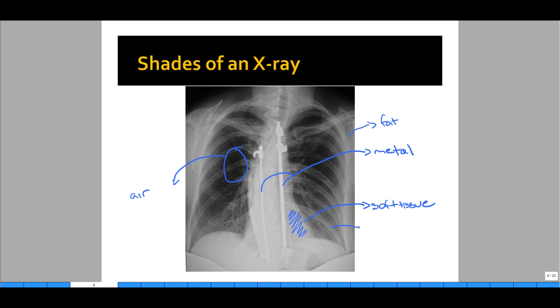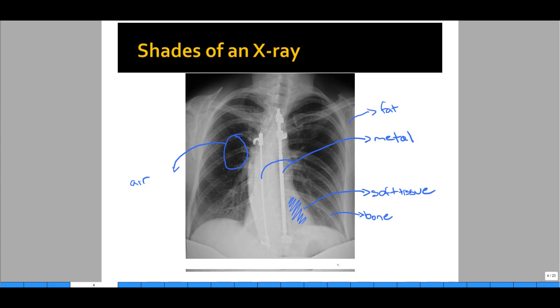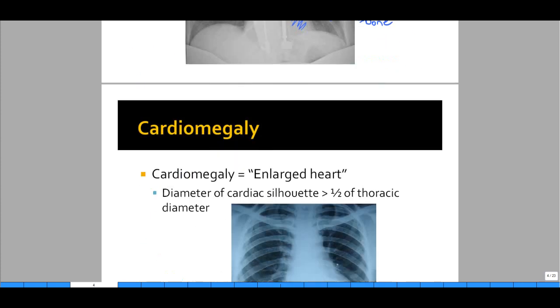Finally, we'll identify bone. Clear ribs are present in the chest x-ray and represent bone. Bone can vary from brighter gray to dull white on the chest x-ray.